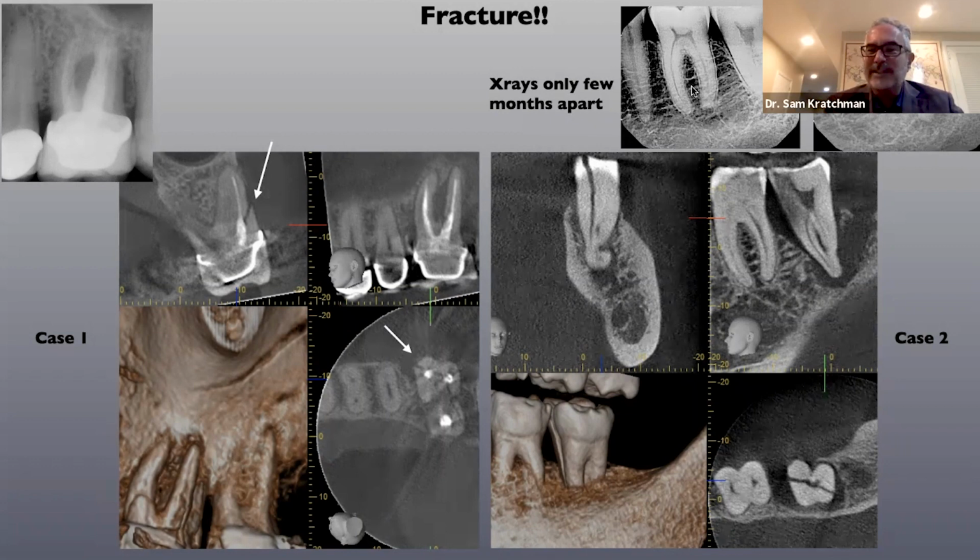This particular patient is actually a friend of mine. He's in his 50s. He's right around my age and has virgin teeth here. And he comes to me with pain. I couldn't diagnose anything. A few months later, he has this fistula. I try to trace it, and I take a cone beam. I'm like, wow, he really did a good job splitting this tooth in half. But this is so clear because there are no restorations in this quadrant and no opposing restorations. That made it easy to make that diagnosis.